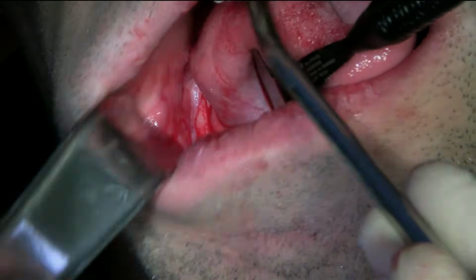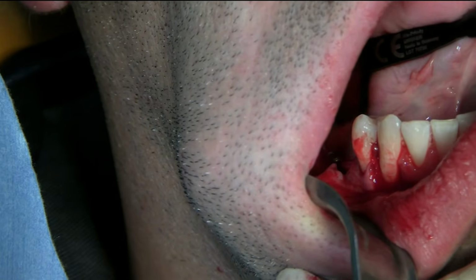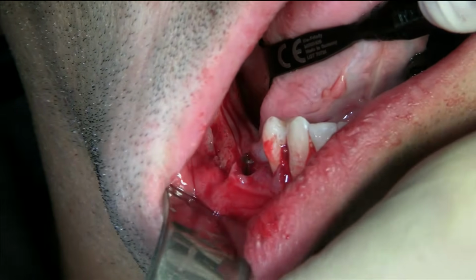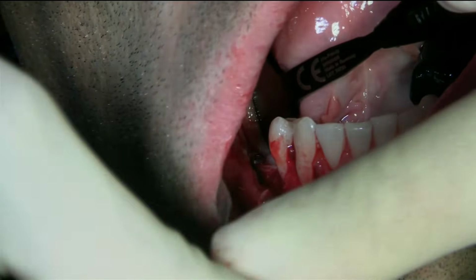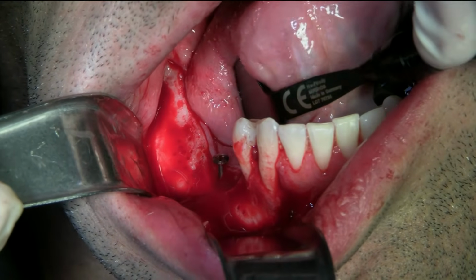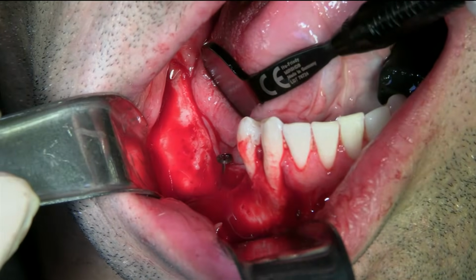Okay, let's start trying to put the membrane in. So I need buccal release. I need here all hands on deck. Okay, like this. And you need to come here. And I need here, yeah, this one.